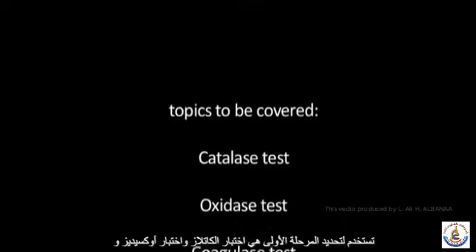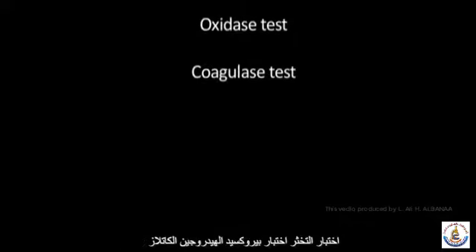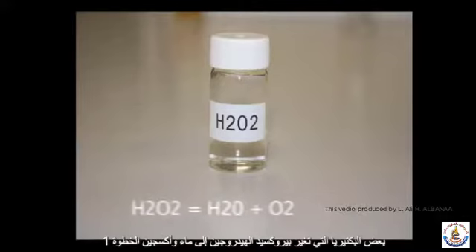The biochemical tests used for first stage identification are the catalase test, the oxidase test, and the coagulase test. The catalase test. Hydrogen peroxide is the reagent used in this test. Catalase is an enzyme possessed by certain bacteria which changes hydrogen peroxide to water and oxygen.